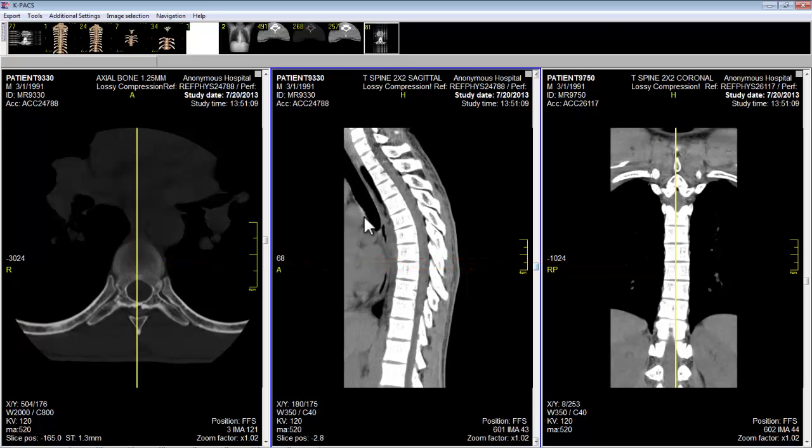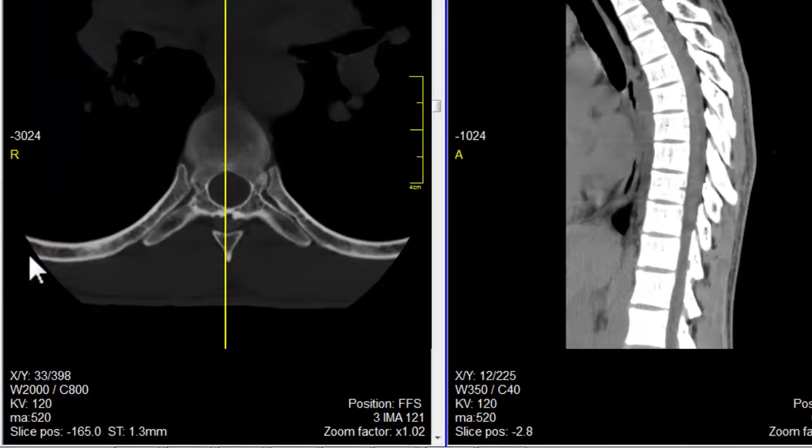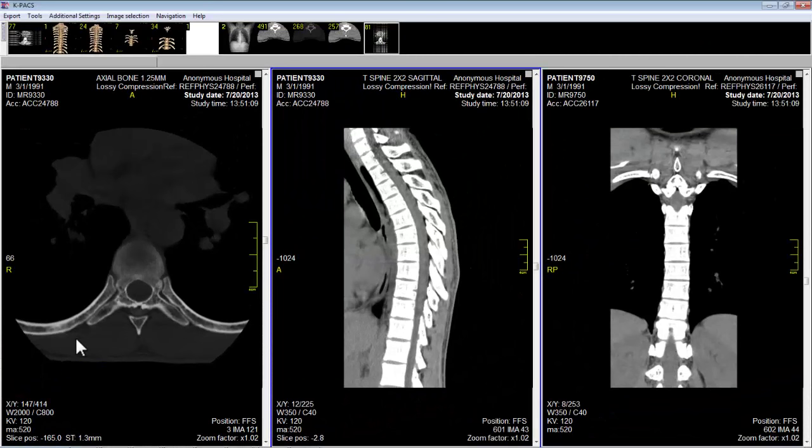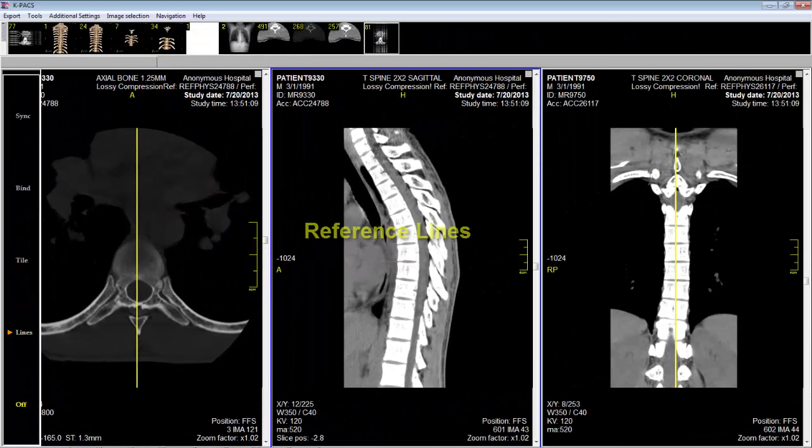To see or get rid of these reference lines, I move my cursor all the way to the left until a menu pops up and you see 'lines'. If I turn lines off, you notice that there are no lines on the screen. If I want to activate the reference lines, I move my cursor to the left, click 'lines', and the lines appear.